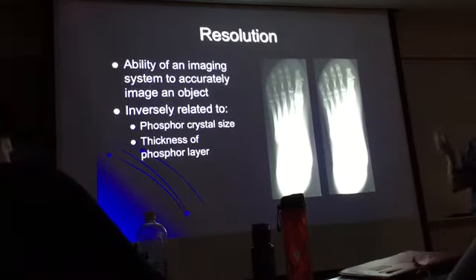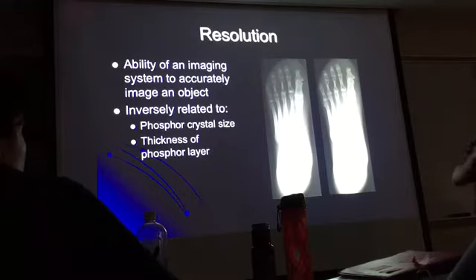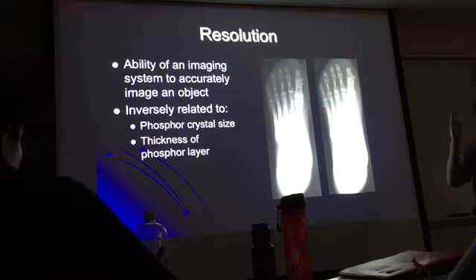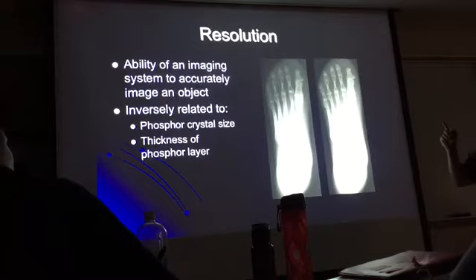Which lines are we talking about? Small lines, say a bunch of little wires, like a restrainer you use for food. Do a radiograph and see how many of those fine lines on the restrainer you can see. The more lines you see, the better the resolution. The same goes with the trabeculae. The more trabeculae you can see, the better the resolution.